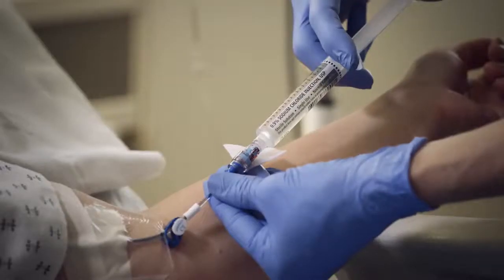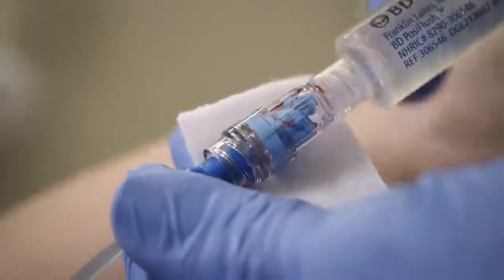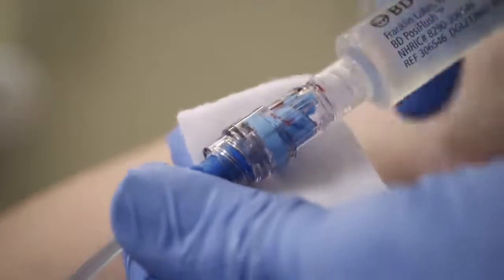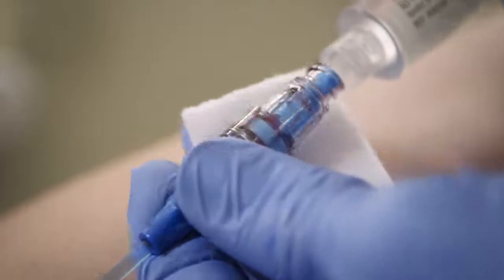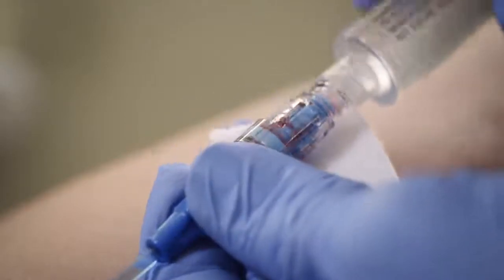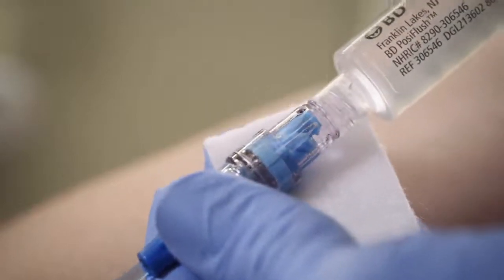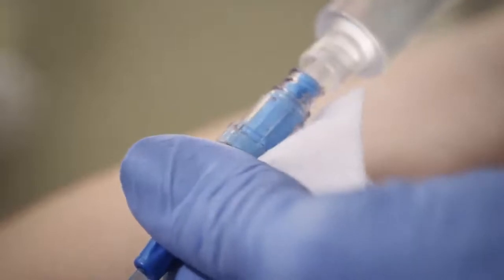Always flush the catheter immediately after infusion or aspiration using a push-pause technique until it is clear. For viscous fluids such as blood or when attempting to flush with low priming volumes, it may be helpful to do a flush, disengage, re-engage, flush sequence. This sequence simulates the recommended use of two syringes when full flush volumes are not indicated for the patient.